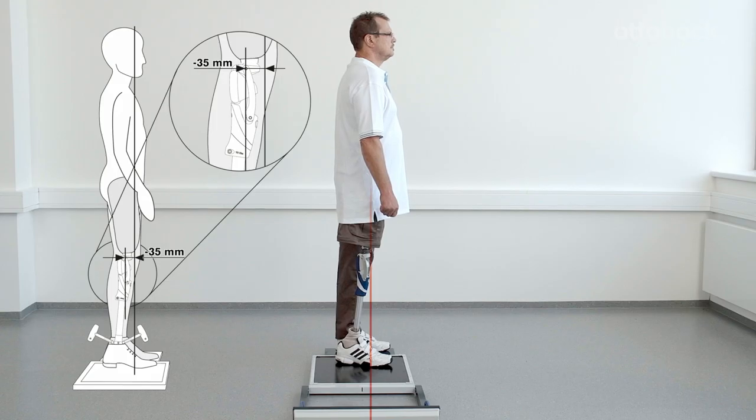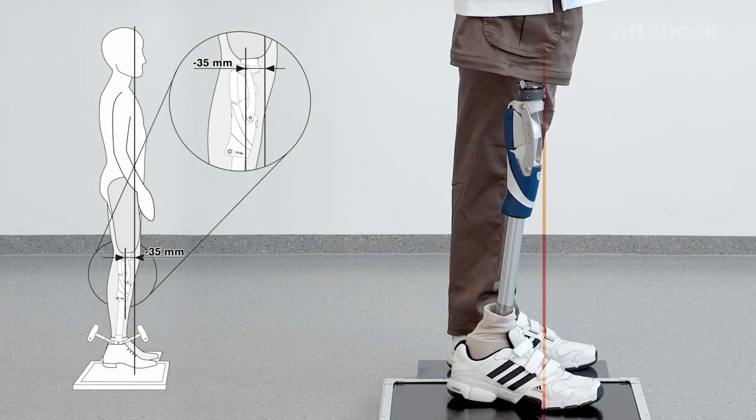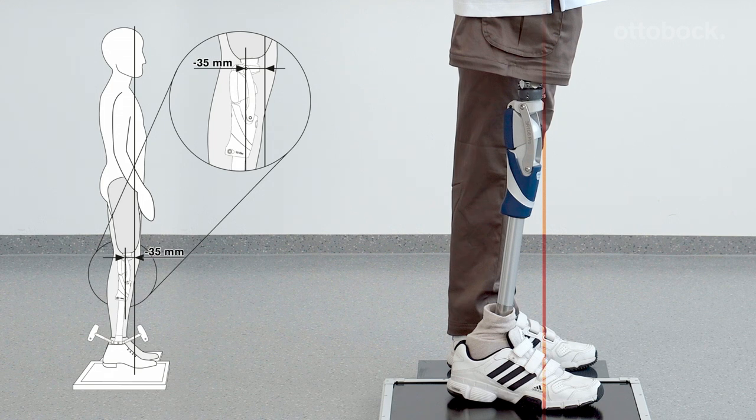The sagittal plane alignment should now be adjusted solely by changing plantar flexion so that the load line runs about 35 millimeters in front of the anterior upper knee axis.